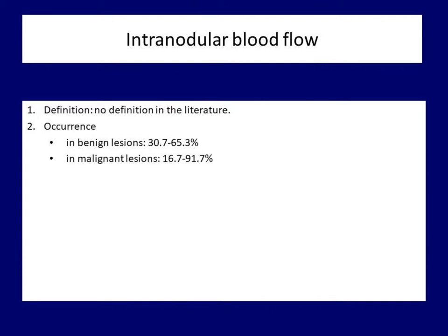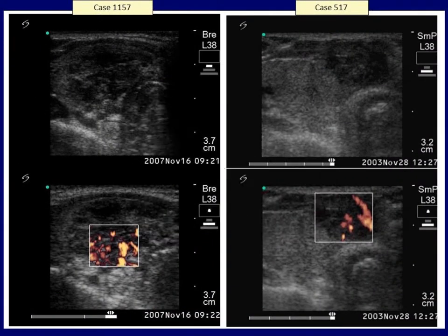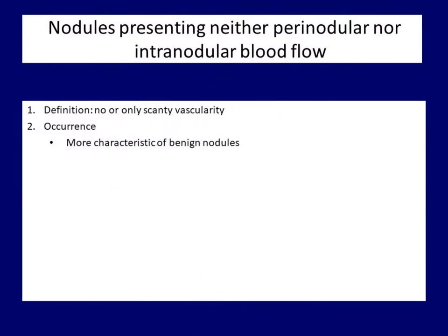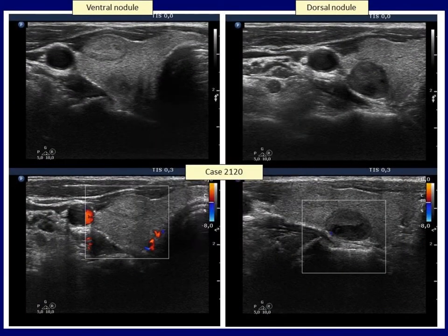The other type of vascularity is the intranodular flow. The huge degree of overlapping between benign and malignant lesions points to the weakness of this sign in differential diagnostics. The first two cases proved to be papillary cancers — in both cases not only is intranodular vascularity present but also markedly and irregularly enhanced. This next nodule also presents increased intranodular flow, but the distribution is more uniform. The third type of vascularity is the complete lack of blood flow within or around a nodule; this pattern characterizes benign nodules.